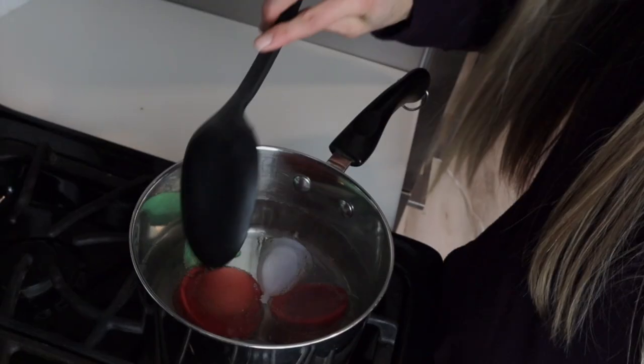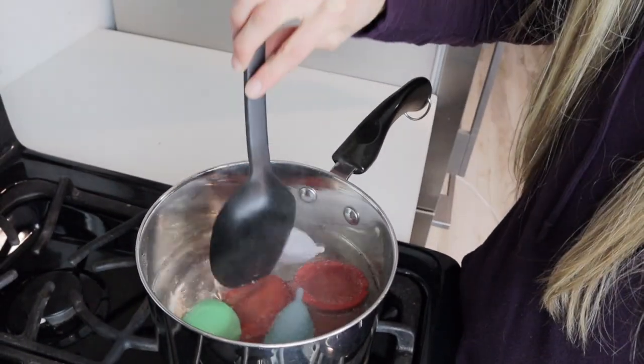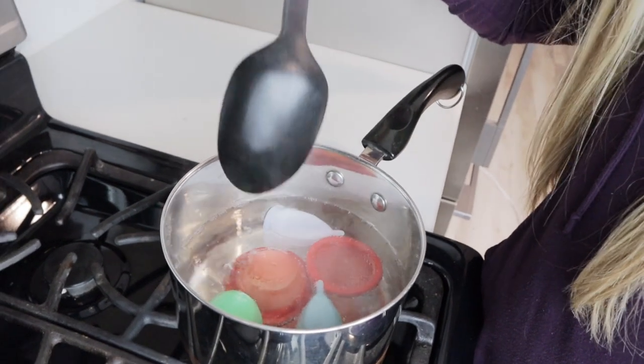A couple of things with boiling your menstrual cups: you want to make sure that they're not touching the edges or sitting on the bottom, as that could definitely do damage to your cup. And you also don't want to leave it in there for like 20 minutes, because again, that's not good for your cup if you want it to last a long time.